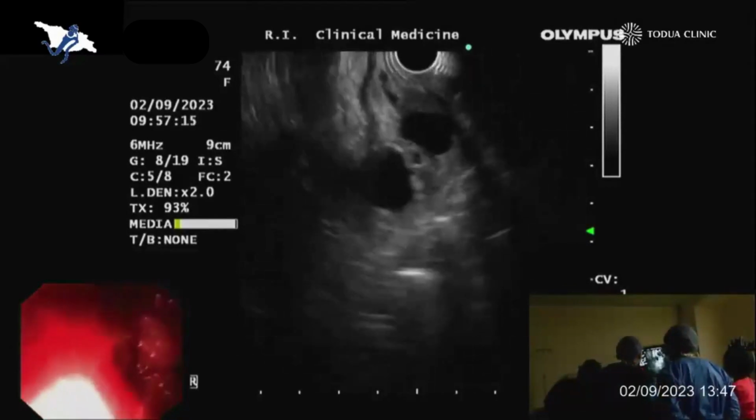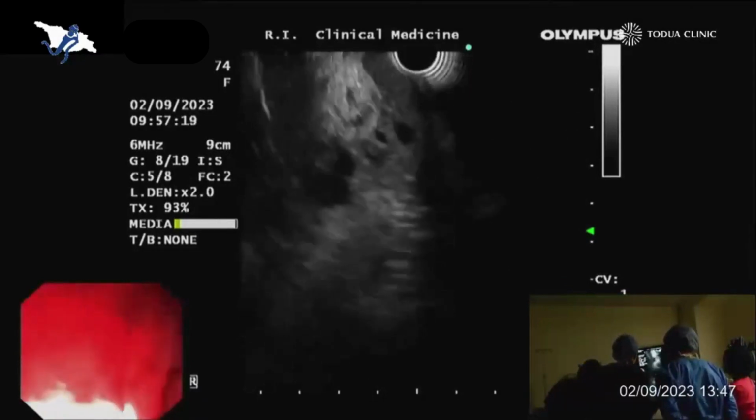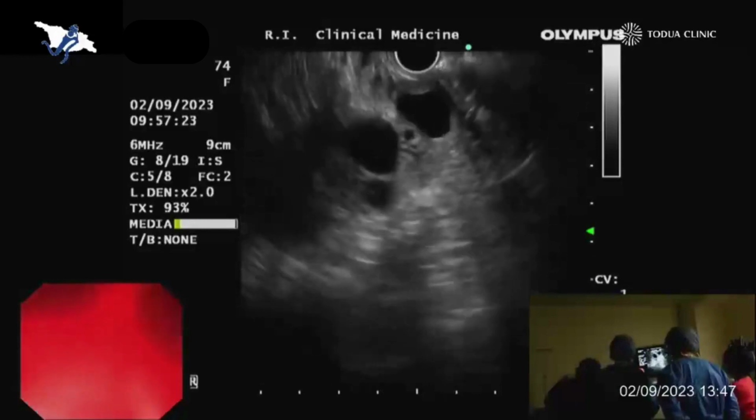He doesn't have a mural nodule, right? I beg your pardon? No mural nodule, right? No.